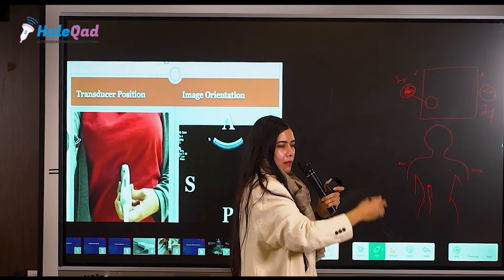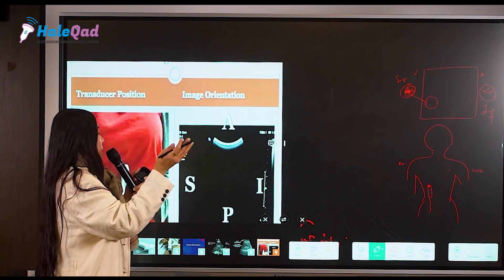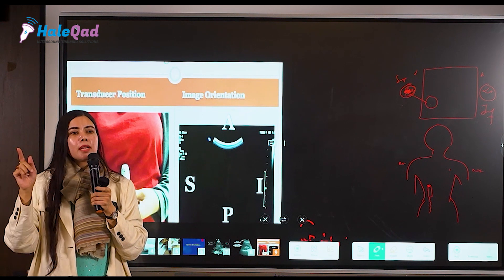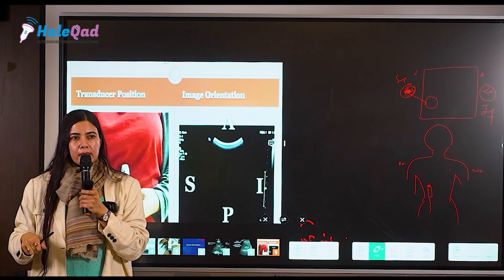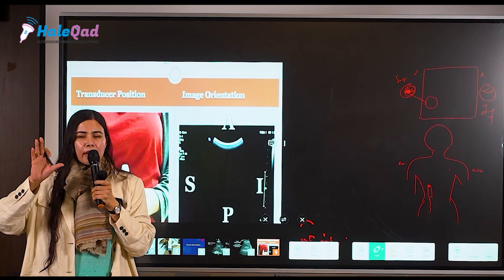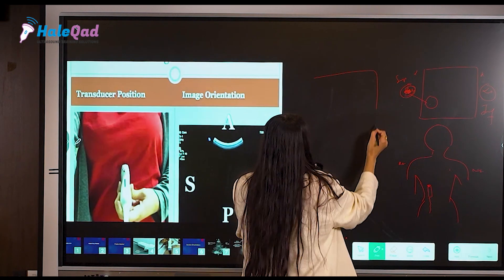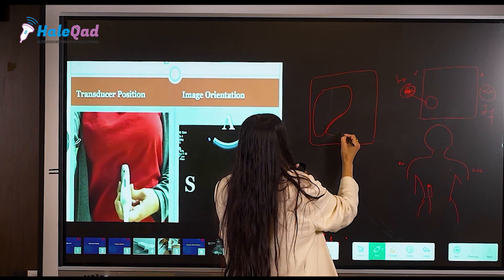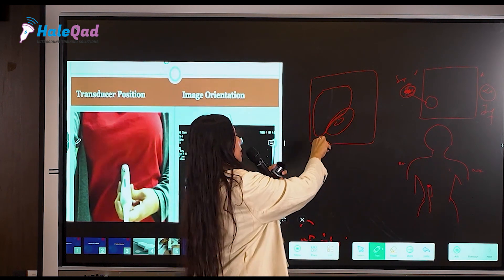The right of the screen becomes superior and the left becomes inferior — why? Because your probe marker is now up in the vertical position. This is important: whenever you are doing scans of the liver or kidney in the abdomen, we will repeat these things. The position of the kidney is such that when you see it on screen — with the liver visible as well — you put your probe in this orientation.